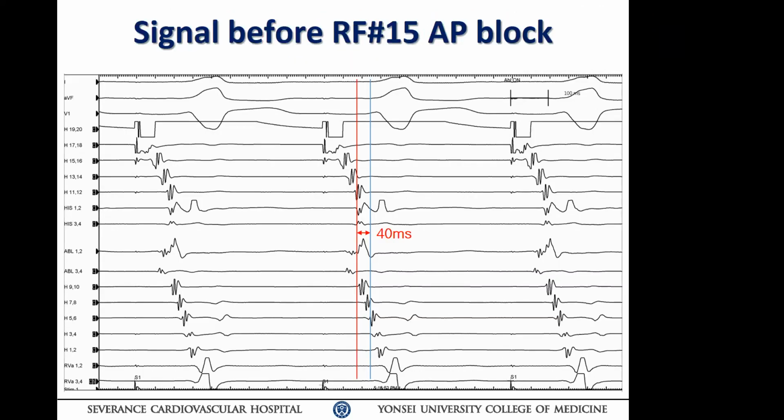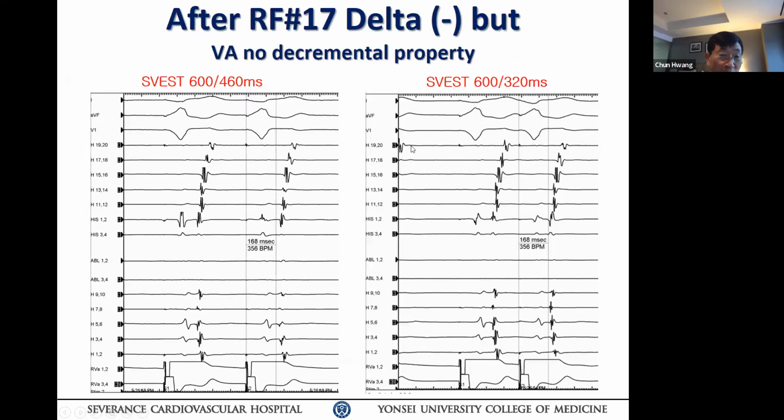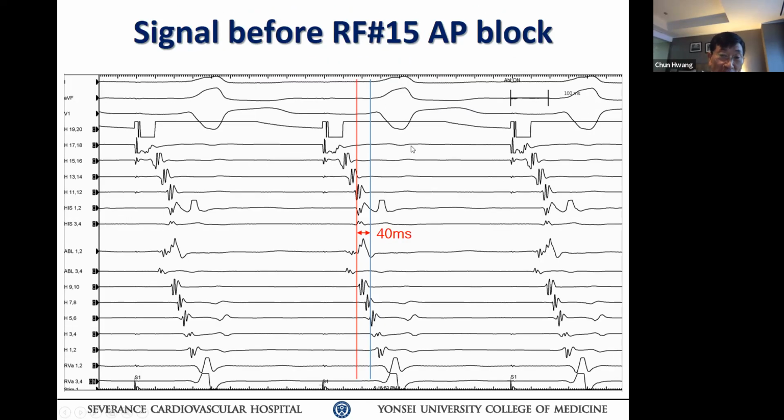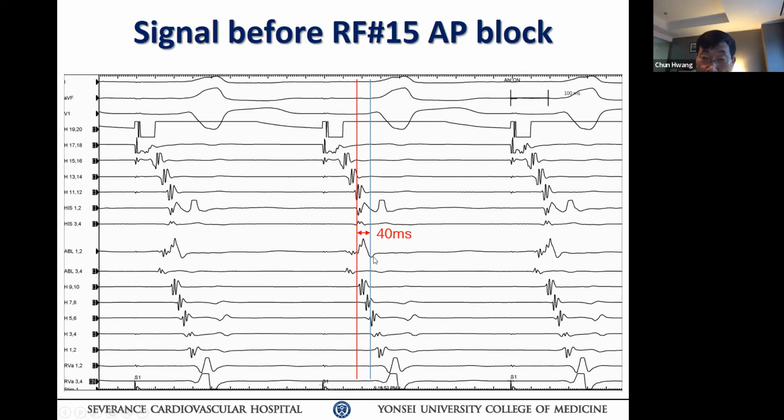So this is the signal before the successful accessory pathway block at the anterior septum. Yes. It looks pretty good, actually, your ablation now. You see that? Big A, look at the A signal now. It's A and B. Yes. And especially the last two complexes are really good.